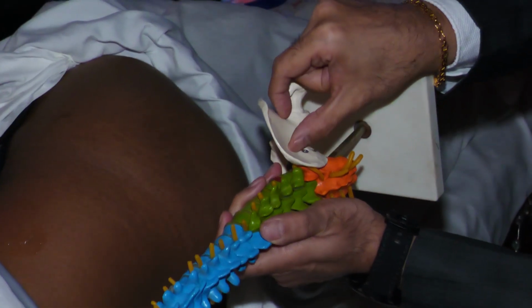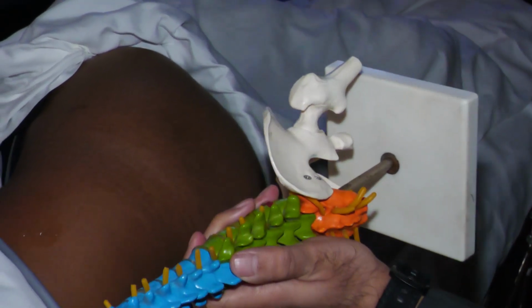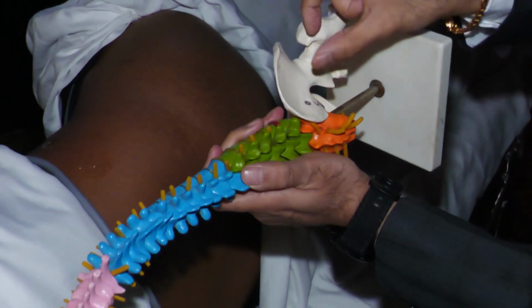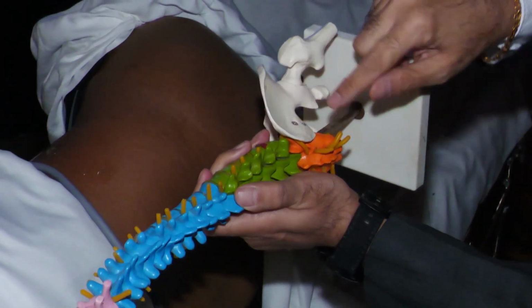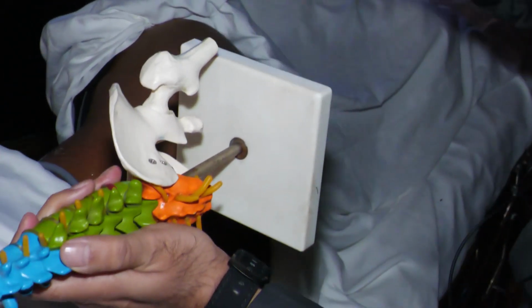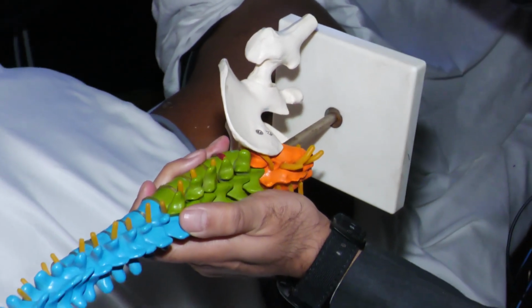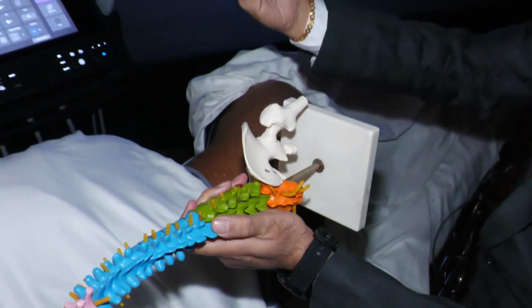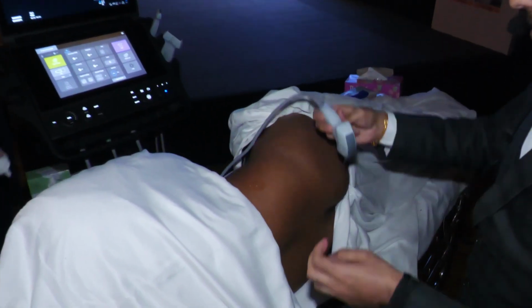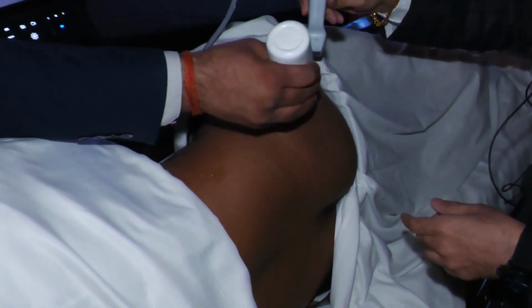So what I will visualize is the ala of ilium and the three muscles. As I move downwards towards the midline in an inferomedial direction, I'll visualize a break. What is that break? The break reflects the greater sciatic notch, and anterior to the pelvis, that is deeper to the piriformis muscle, we would visualize the sacral plexus. So can I have jelly, please?